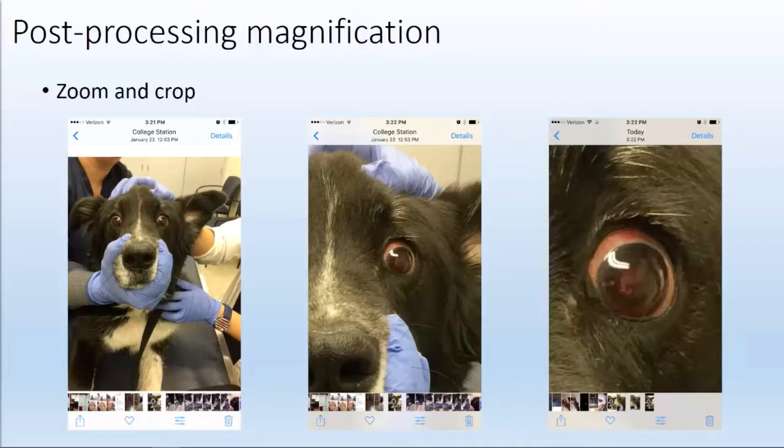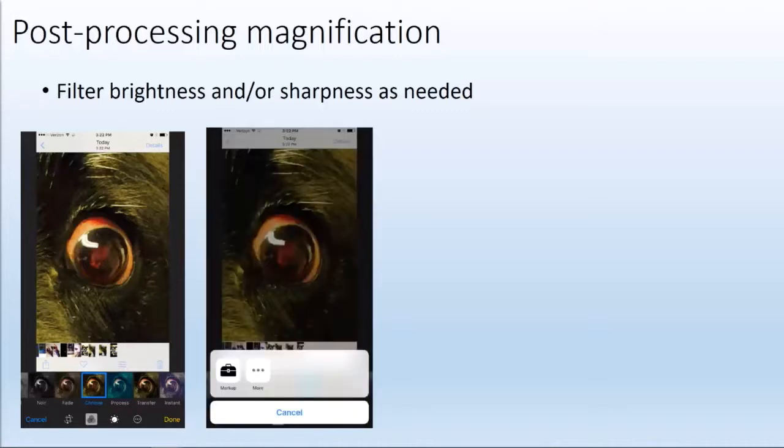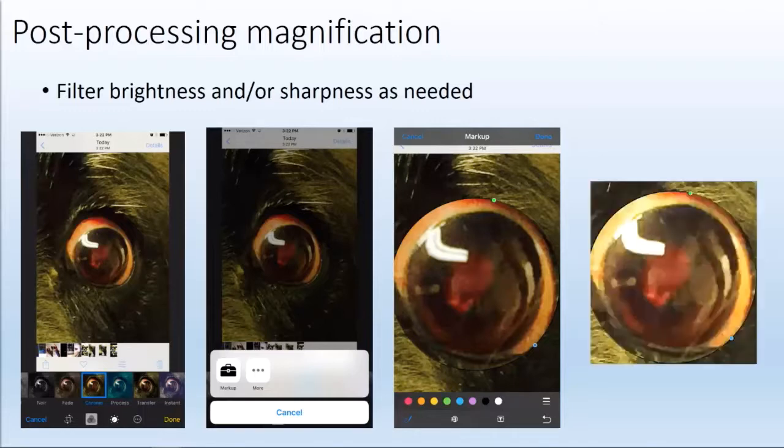Whether it's an Android or an iPhone or Apple-based technologies, if you have the inclination, there are little buttons on the bottom of your natural camera software that allow you to use post-processing options. Mostly these are used for Instagram filters for making things look sepia toned or whatever you want. But you can use them to your benefit. I clicked on the little option here, and it gave me a magnifying glass option, which seems to sharpen and enlarge. That little circle around the eye now is enlarging it about another 2x. And this is our final product.